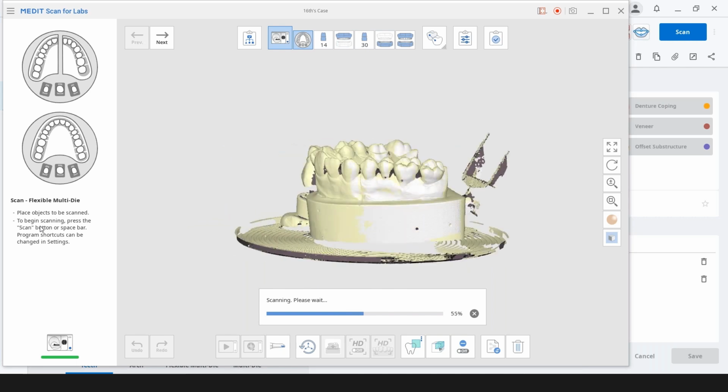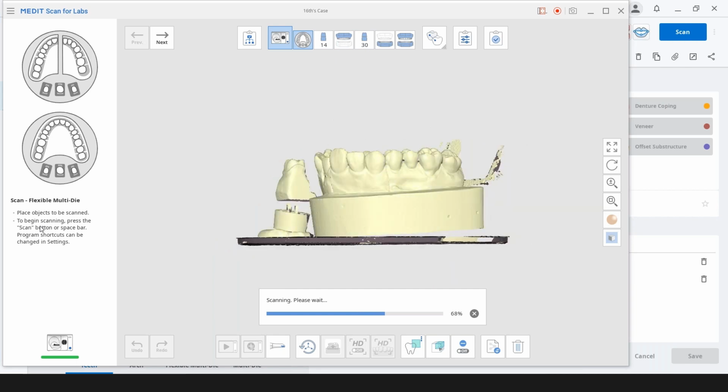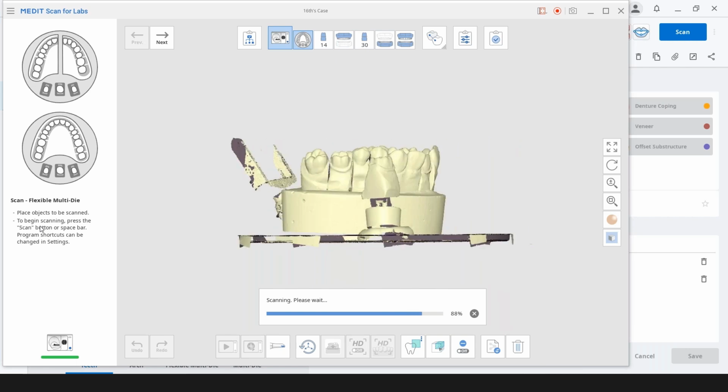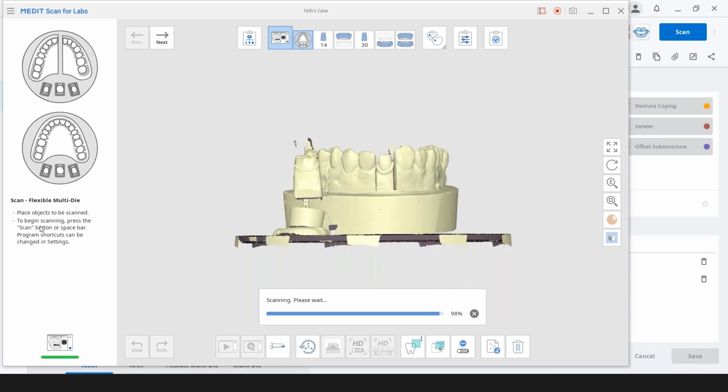Now, Jeff, while this is scanning, is it important to leave space between the die and the model? Sufficient space? Absolutely. We talked about that earlier, especially if you have a multi-die plate. We've got 6 or 10 dies on there. You want to have space between them so it can capture the mesials and distals.